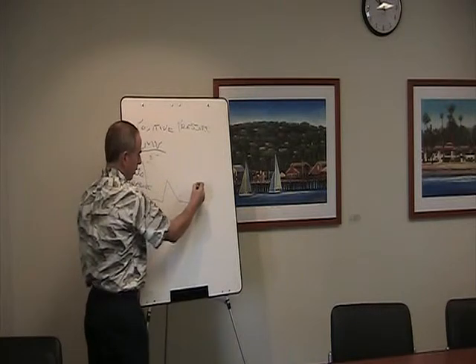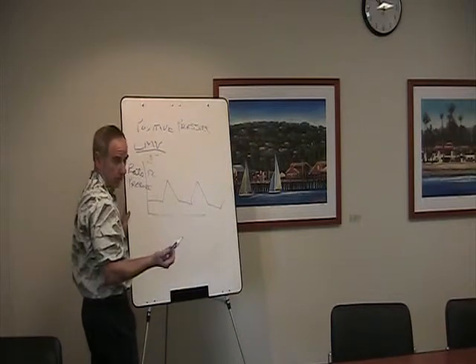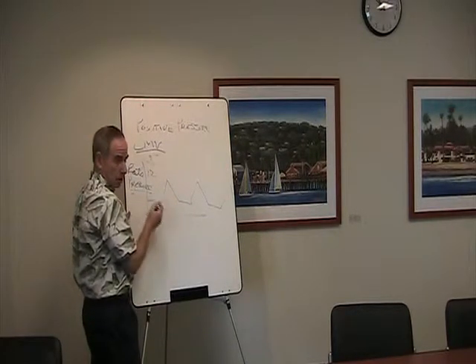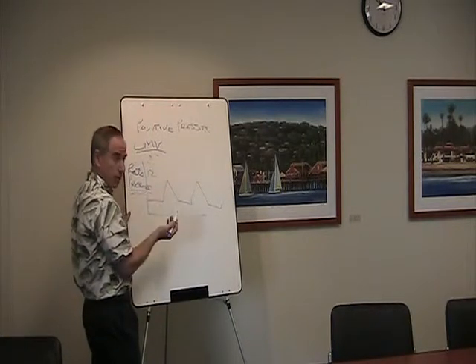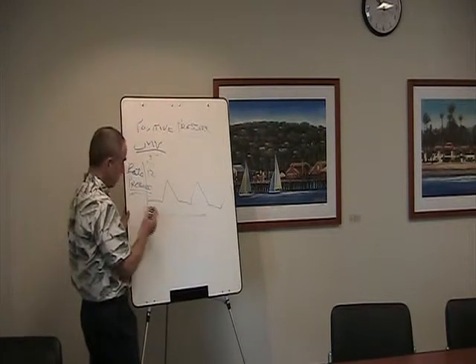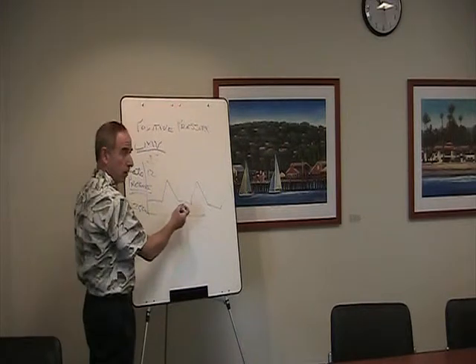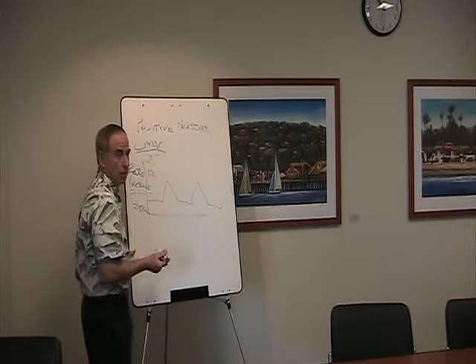And depending on the rate, if you set the rate at 12, that goes into 60 seconds, so every 5 seconds the ventilator would trigger, and it would give them a mandatory breath. It was a pressure controlled or cycled breath, which means that you would set a pressure and it would give that amount of pressure. It wasn't a volume, it was a pressure. So you might give 25 centimeters of pressure at a rate of 12, so every 5 seconds it would trigger. Now, if the patient were to take a breath in between these mandatory breaths, what would happen?